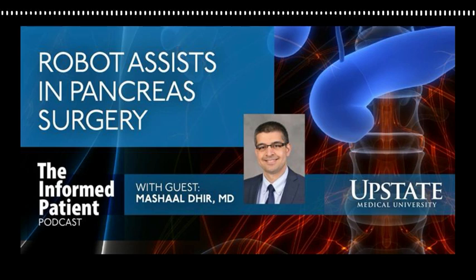I understand that you now have robotic assistance for a major surgical procedure nicknamed the Whipple procedure. What is this procedure for? This procedure is named after the surgeon Ellen Oldfather Whipple. It's basically removing the head of the pancreas and first part of the intestine called duodenum and bile duct. It's mainly for cancers arising within the head of the pancreas, the lower part of the bile duct, or first part of the intestine called duodenum.